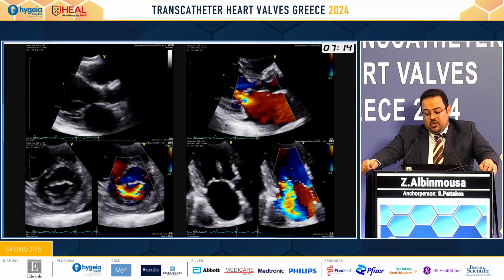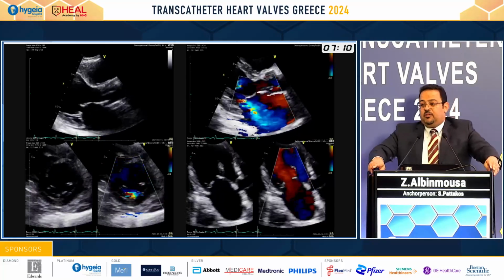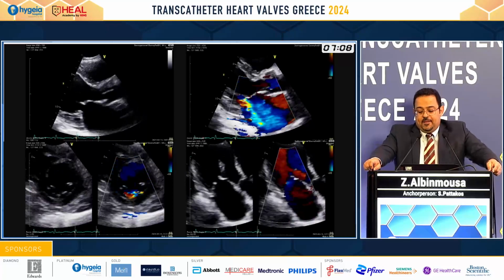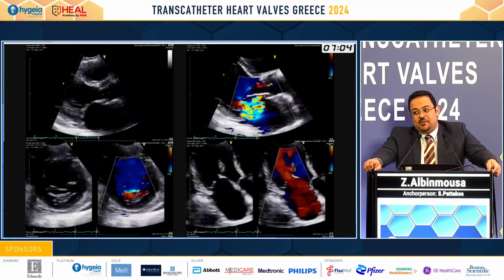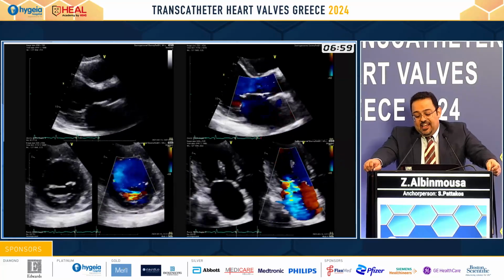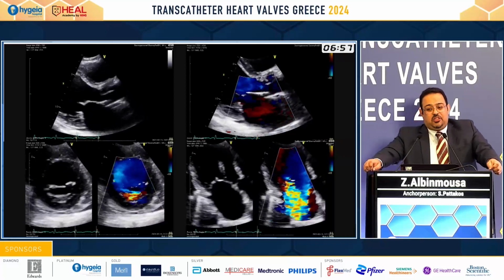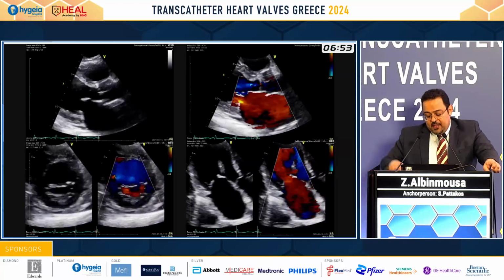But the question: what do you think about the posterior mitral valve leaflet? It's functional, let's say. Do you agree or not? We were really concerned about the posterior mitral valve leaflet, and we thought there were some rheumatic changes.